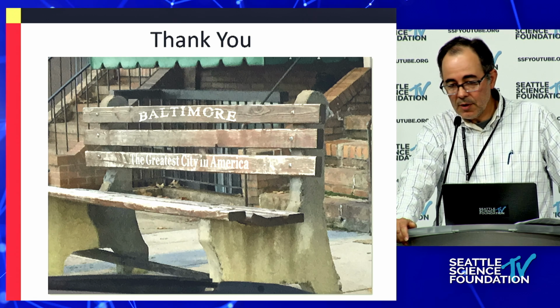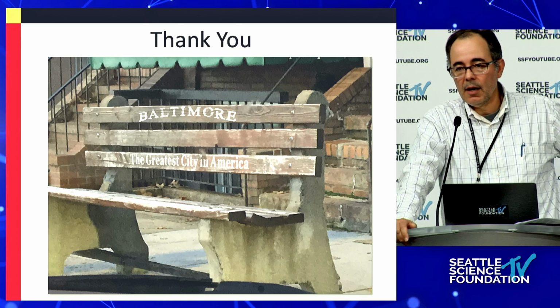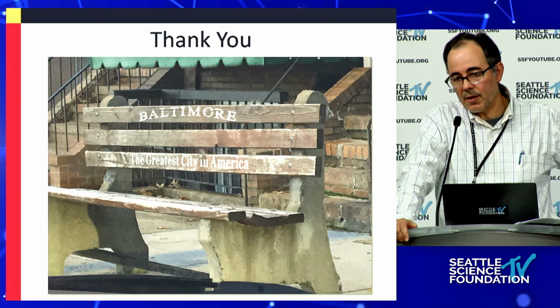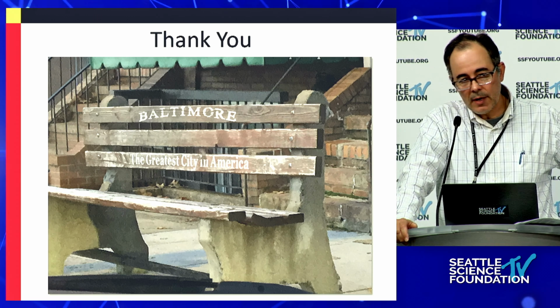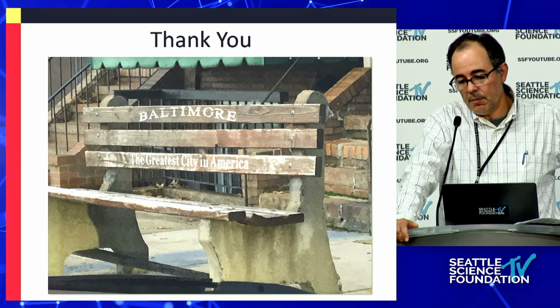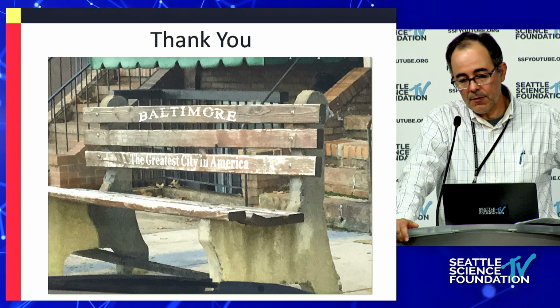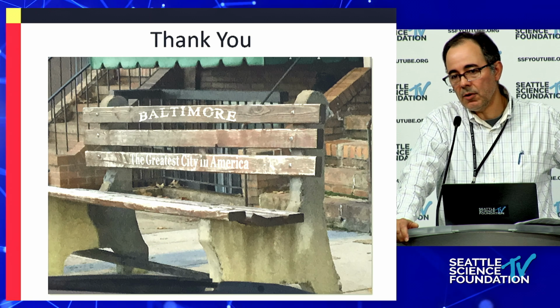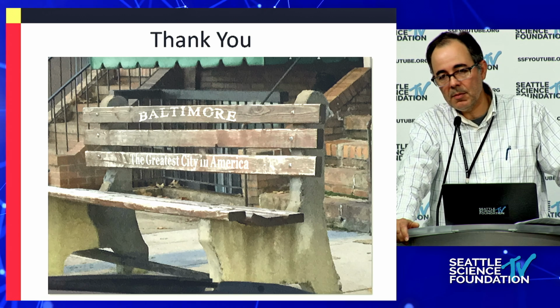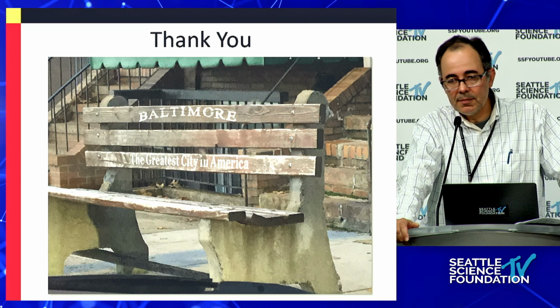There's a risk of residual pain in the setting of radiculopathy for patients who have foraminal disease. I think it's very common to not be a perfect candidate for arthroplasty and therefore be thrown into the realm of fusion, just because you don't have to think about it as much. Fusion is more forgiving. You can be off center and still have a fine outcome. You can do an inadequate decompression and still have resolution of symptoms.